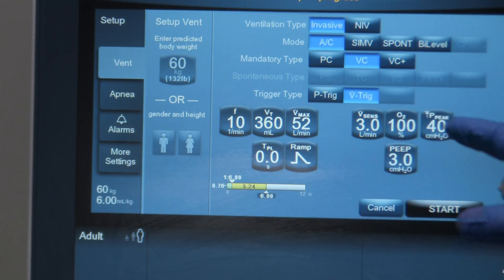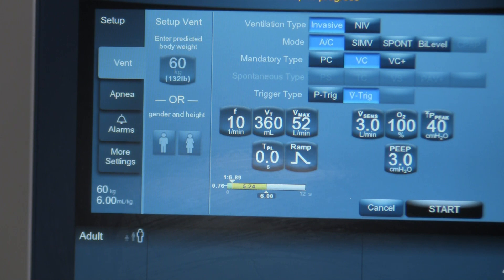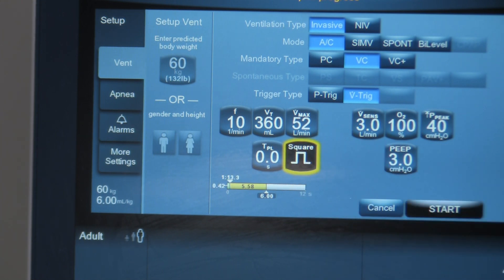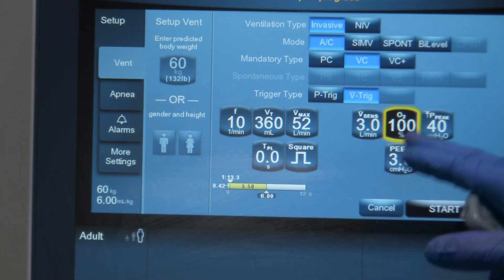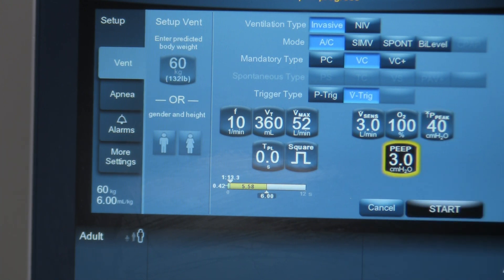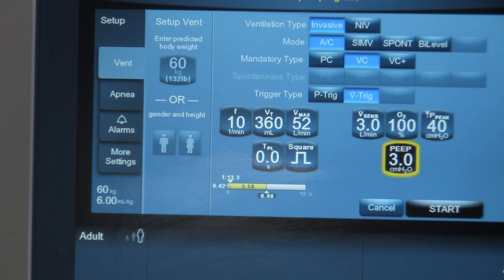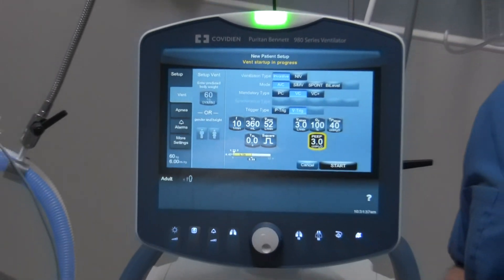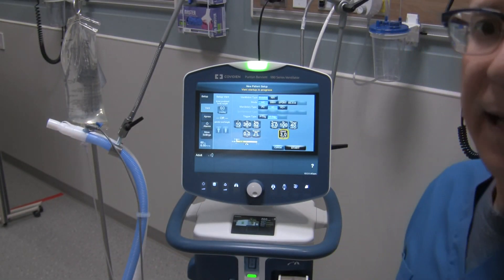At this point you want to look at all your settings and program them specific to your patient. After assessing your patient, determine the respiratory rate, tidal volume, waveform type, flow rate, triggering type, FiO2 delivery, and high pressure alarm. Once you've programmed those settings and set your alarms appropriately, you can hit the start button and the ventilator will begin ventilating your patient once they're attached to the circuit. That covers the key features of the PB980 ventilator startup menu.